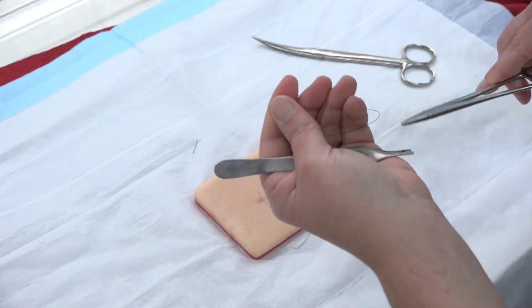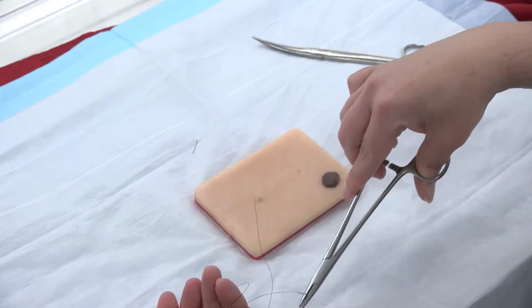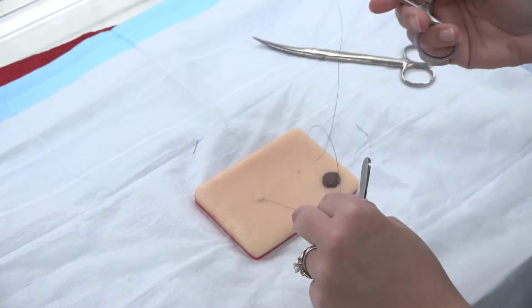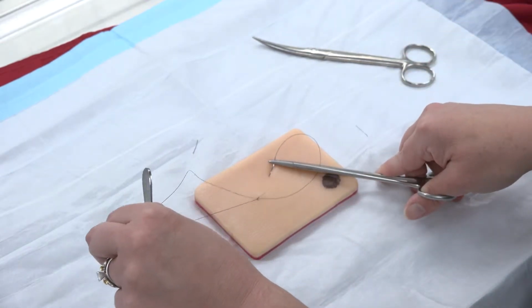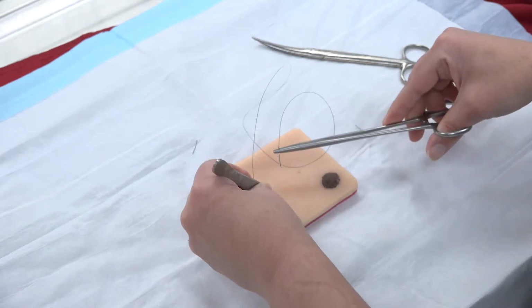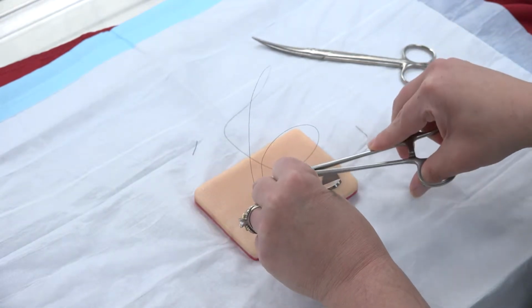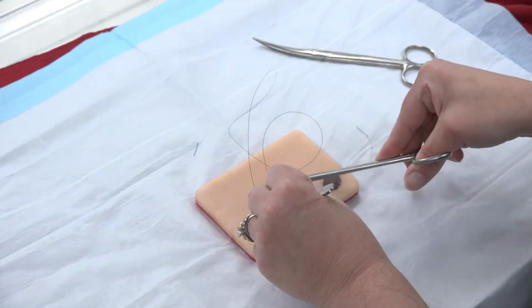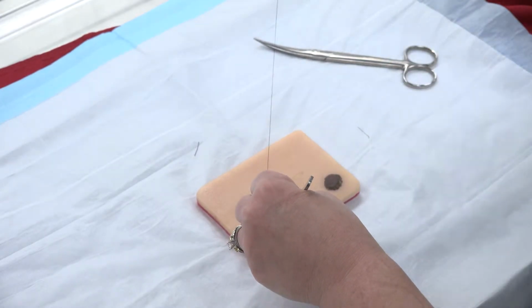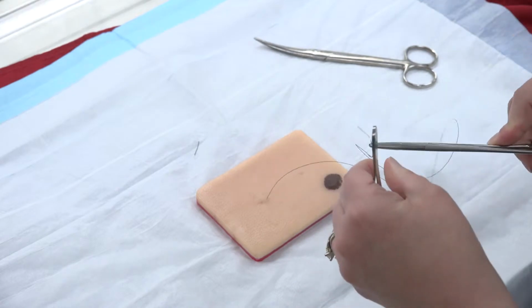A big mistake beginners with subcuticular patterns make is that my knot is deep, but if I start now with my needle superficial, it pulls the knot back up to superficial. So what I'm going to do is start deep for my first suture, again on my side because that's the easiest, and I go deep to superficial again. And now my suture is superficial.